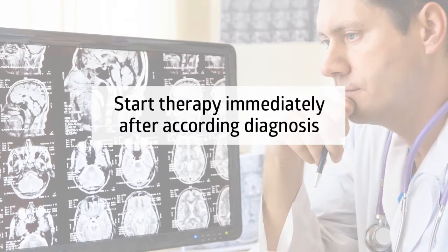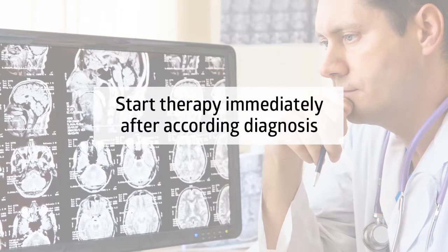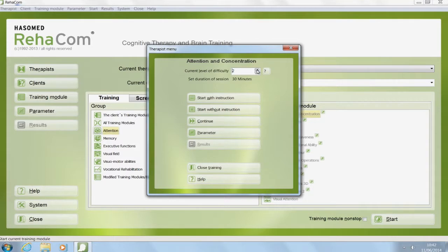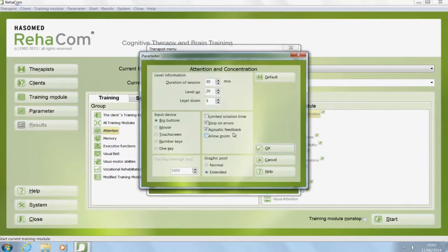It is important to start therapy immediately after the diagnosis. Before starting the training module, it is possible to individualize the training parameters via the therapist menu. One can adjust the level of difficulty, duration of session, instructions, help, or stressors according to the patient's needs.